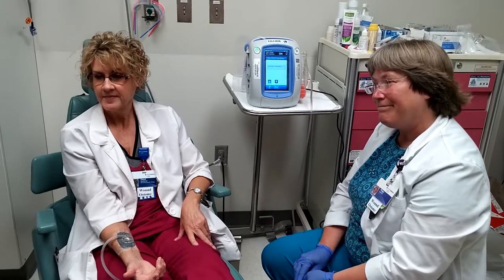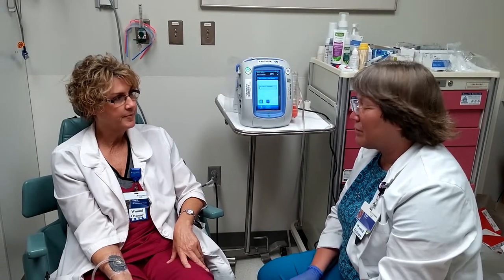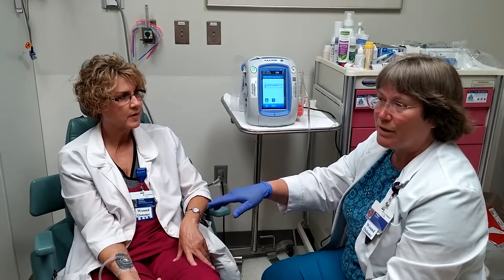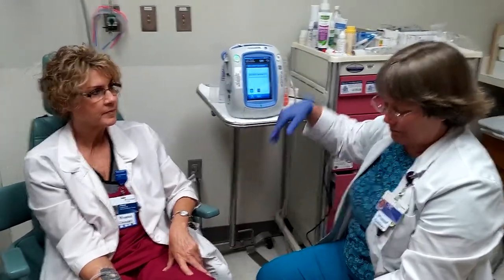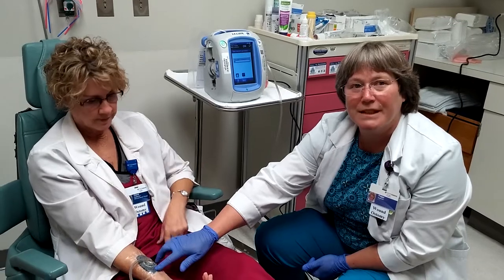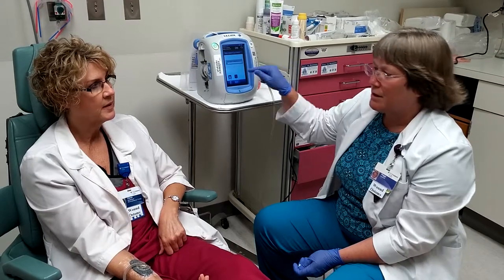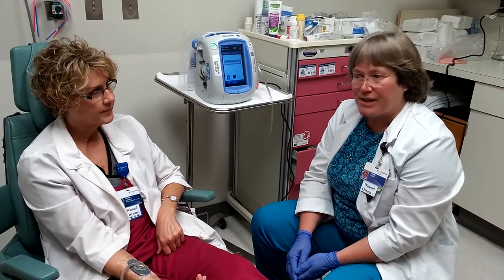The last question is problem solving. Your alarms are going to be part of your problem solving. If for whatever reason it's alarming and you cannot get it to stop, you can't figure out what's wrong, or it says blockage and you've reset it, powered it off, and re-ramped it up — if it's still not sealed, the rule is it's not supposed to be left in place for more than two hours with the suction off. So something needs to happen; you can't just keep pushing the button all night long.